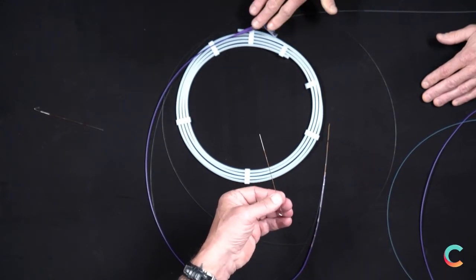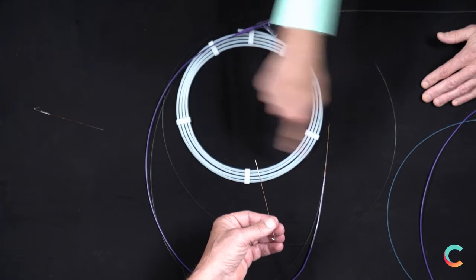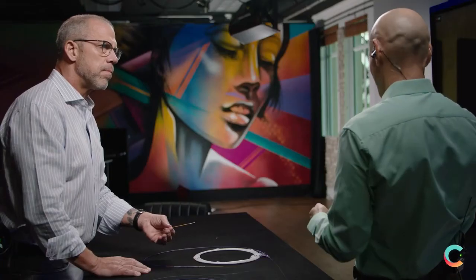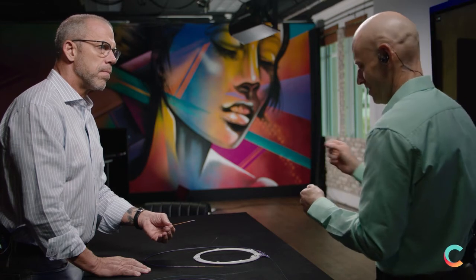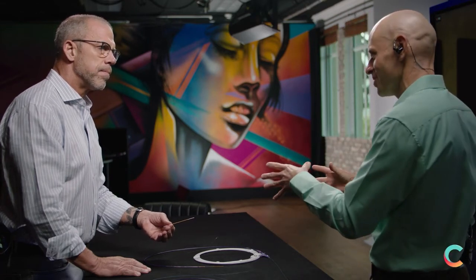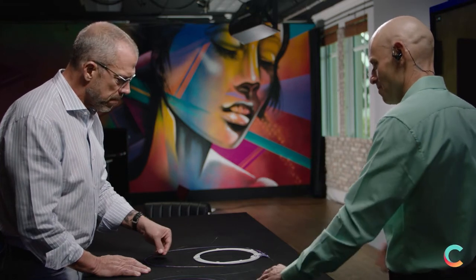And then you can use the same backbone, the same base module, for all of those adapters. So you're basically adapting your equipment for what's happening during the procedure. Instead of exchanging a guide wire, I'm just going to downsize my catheter, so I'm using a smaller guide wire. Those are the types of embodiments we're thinking of.